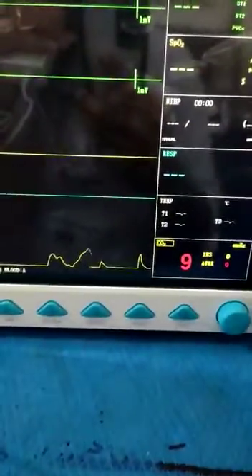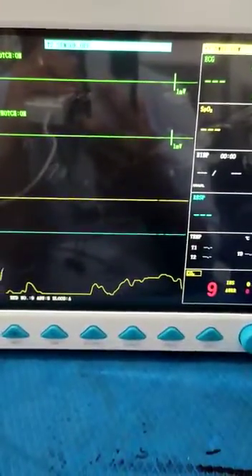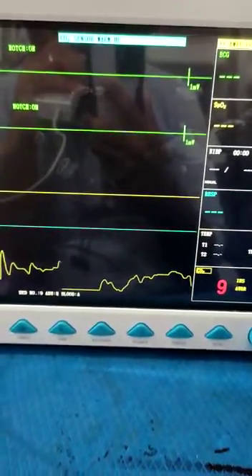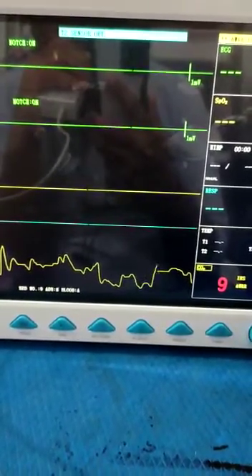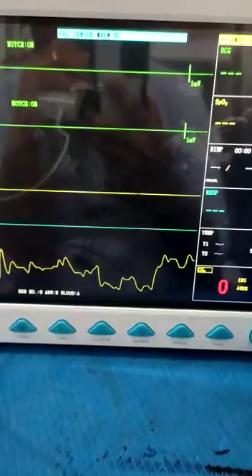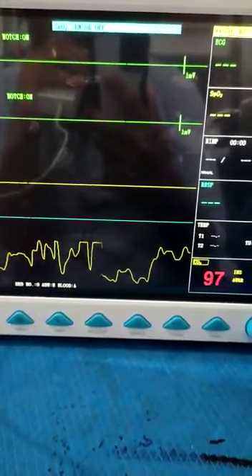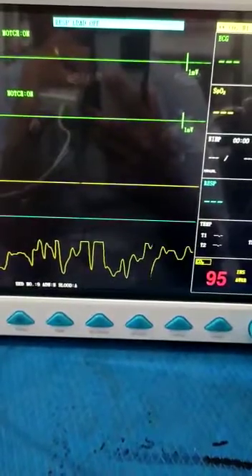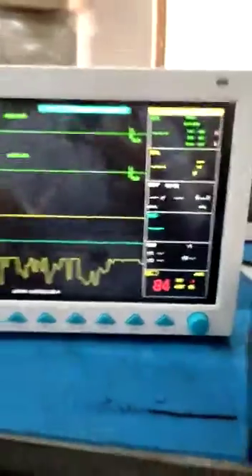If I blow some air into it, you can see the reading changes. This demonstrates the function of the EtCO2 module — this is how we get the EtCO2 reading on the CMS 8000.